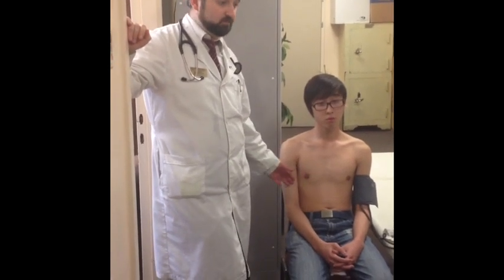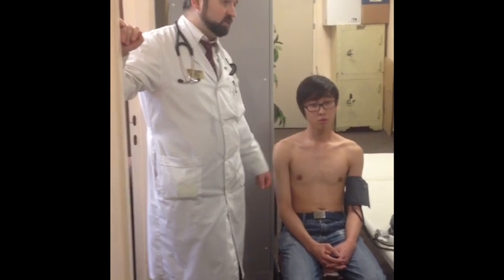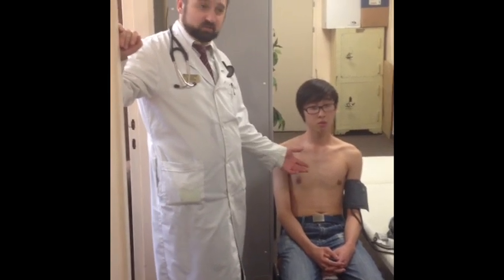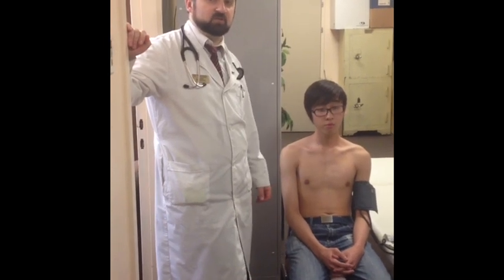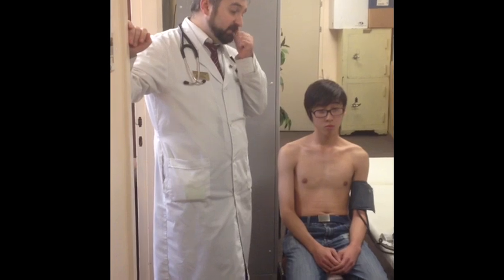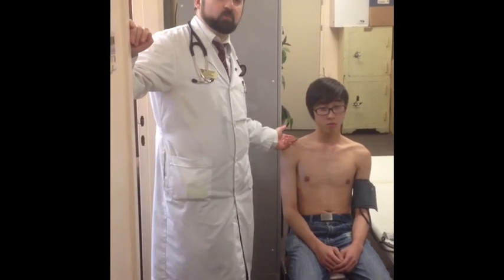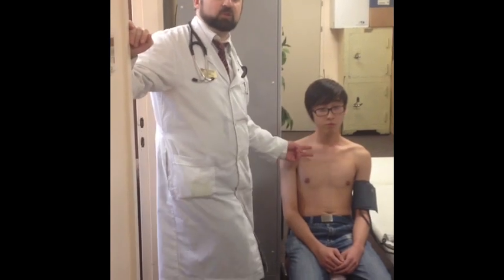So you can see that measuring blood pressure in a patient for the first time is a relatively long procedure — about 15 to 20 minutes when done properly. Then we do the same on the right arm. Later, when we already know the patient, we can measure only one arm, maybe two times.